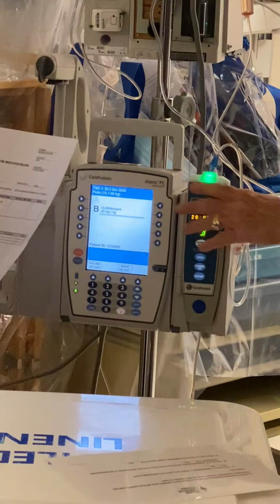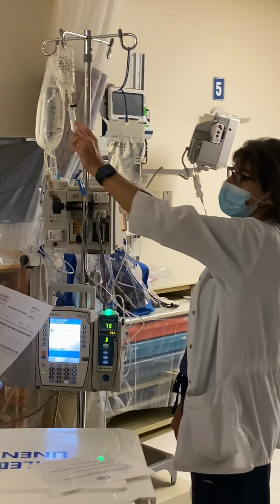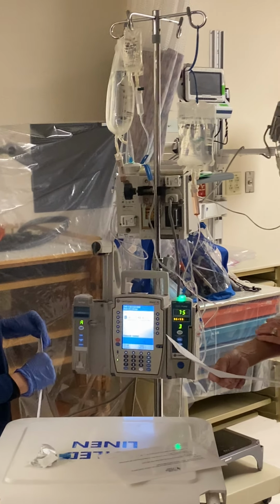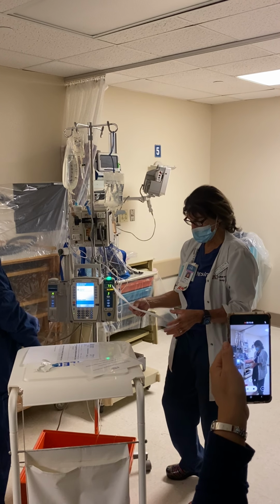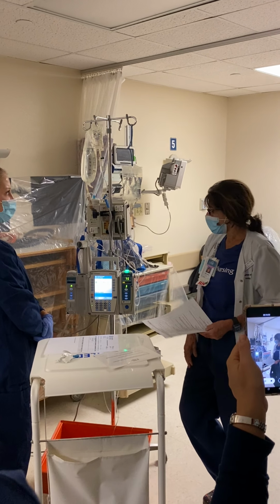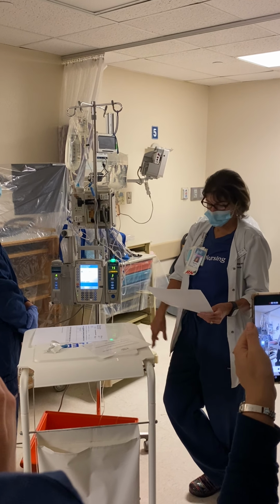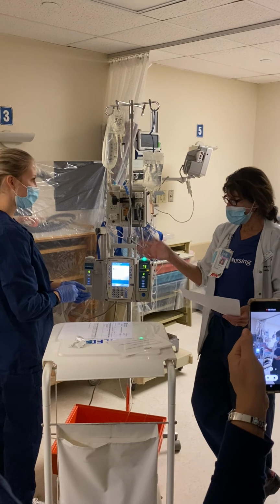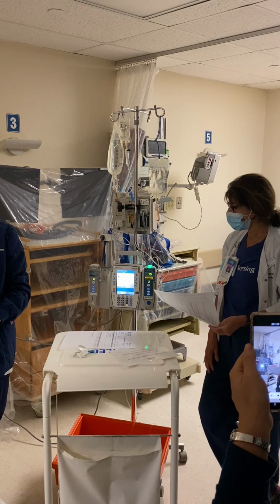This says clindamycin. This isn't part of your testing, but technically part of your testing is that you would look to make sure the drips are in the drip chamber. You would check the IV site and make sure that it's not irritated. Ask the patient how they're feeling, because you're hoping they don't have any type of reaction. If they say everything is great, then you're just going to give them the call light. You're going to lower the bed and put the rails up, do hand hygiene, take off your gloves, and then you're going to document and record.